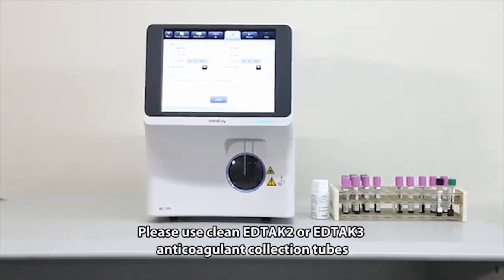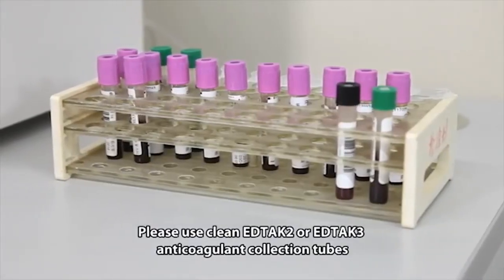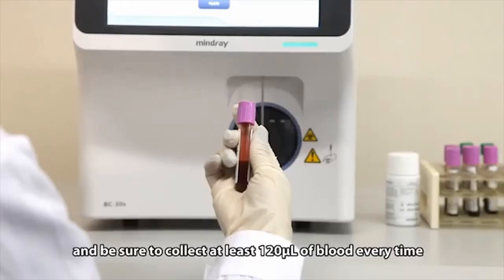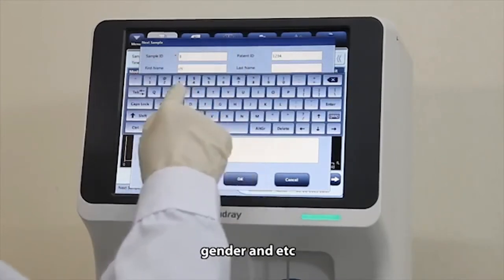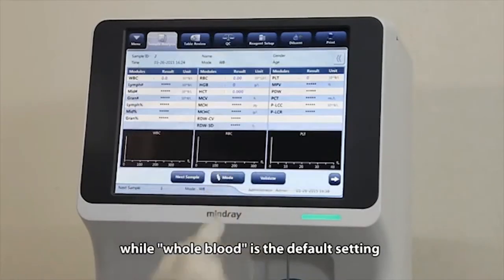Please use clean EDTAK2 or EDTAK3 anticoagulant collection tubes to collect venous blood samples, and be sure to collect at least 120 microliters of blood every time. You may enter the patient information, including sample ID, name, age, gender, and etc., while whole blood is the default setting.